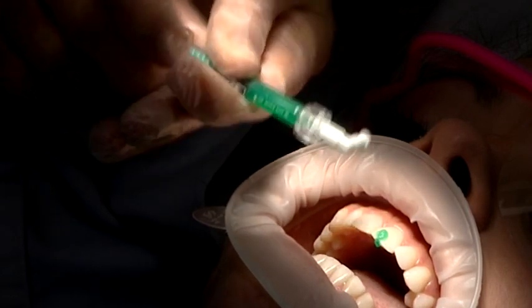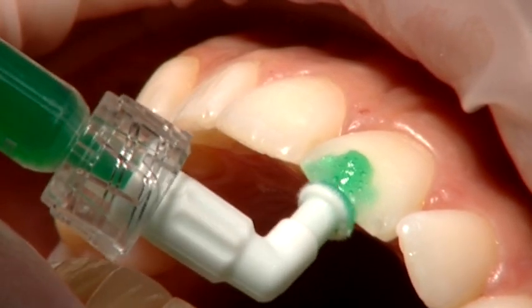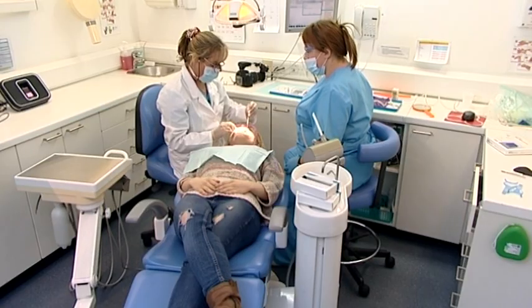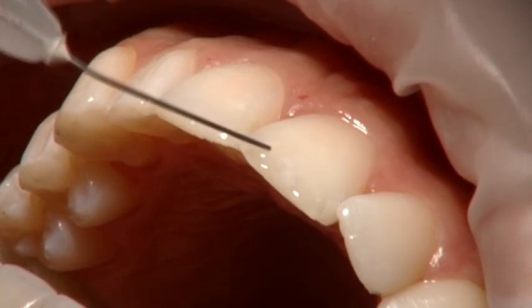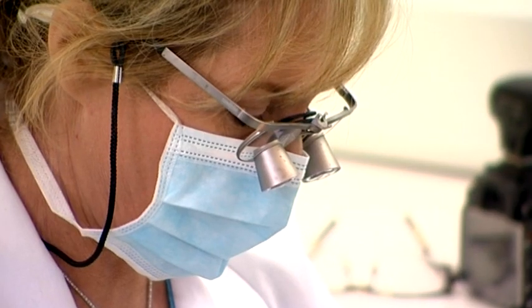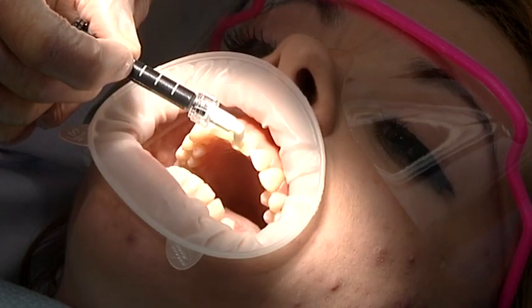It has three phases. The first phase uses 15% hydrochloric acid, which cleanses and opens the pores of the enamel. Then alcohol is gently applied to the tooth, which dries out that surface. And then the resin is infiltrated onto the surface of the enamel.